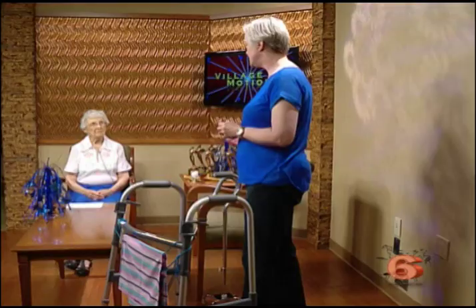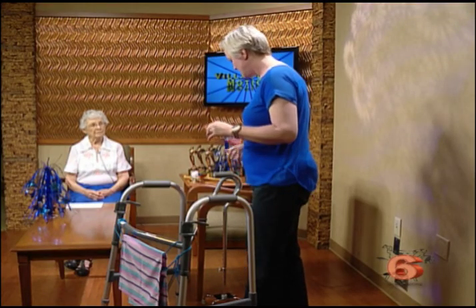We're more than welcome to size your assisted device for you, make sure it's the proper height. We do that all the time with people that we see that come to Garden Ridge for therapy. They'll say, oh, I have a walker, my own walker at home. So we'll ask if family can bring the walker to us so we can take a look at it, just to make sure that it's in safe working order, that the height is good, and if any adjustments or modifications need to be made.